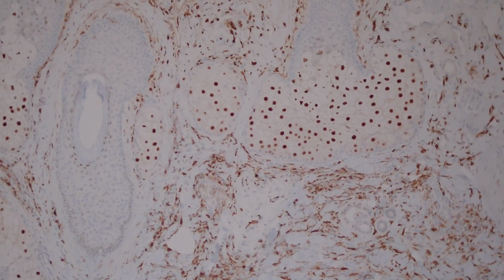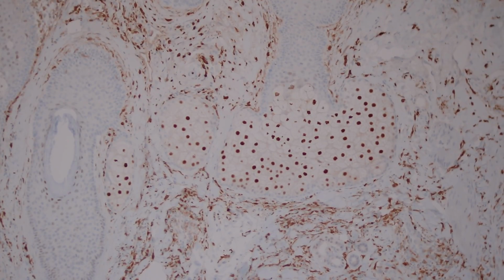And the other thing, interestingly, and it only works with one clone, this is a clone that's called AC-1A1. That clone of Factor XIIIa does this really unique thing where it stains strongly the nuclei of sebaceous cells. And so that can be useful in looking for sebaceous differentiation in sebaceous tumors. And that was something that I noticed when I was a fellow, and I noticed it because of looking at controls, and I did research and practice, and we recently published on that in the Journal of Cutaneous Pathology, and I will post the link down below.